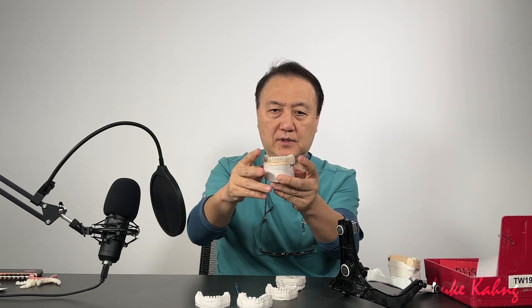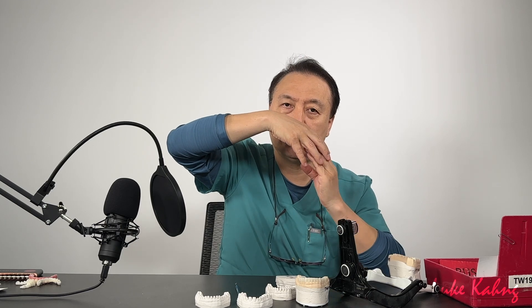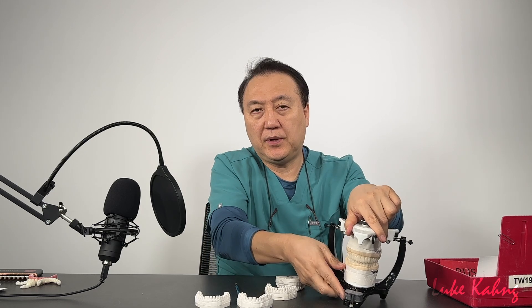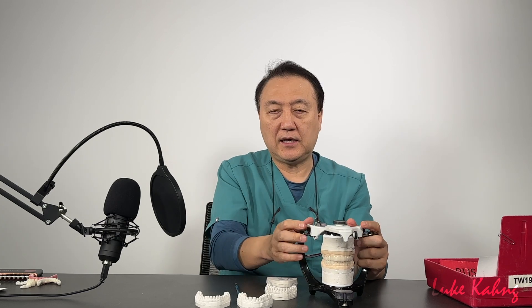Once I set up the teeth, canine is a little low — I bring the tooth set up contour down like this. The lower molar is not straight; the lower molar is positioned like this, so upper contacts together and then movement. Once I do that, I can build up the upper and check movement between the teeth, and then I can finalize it.